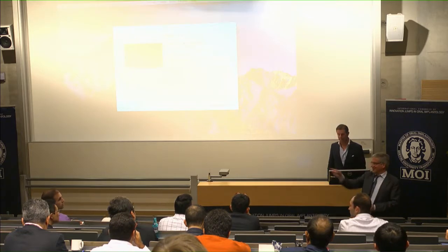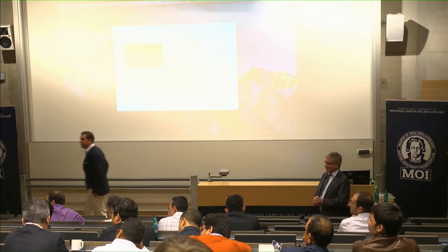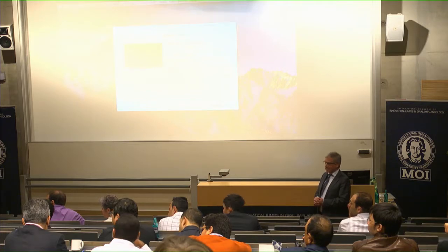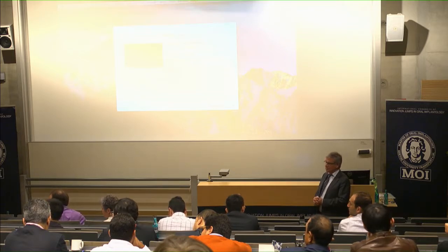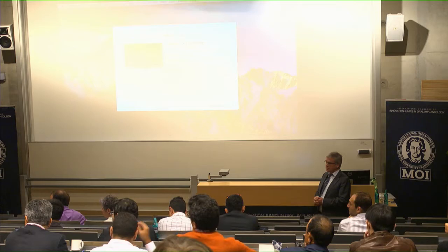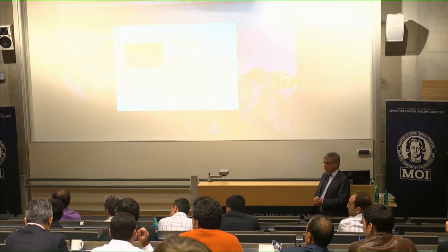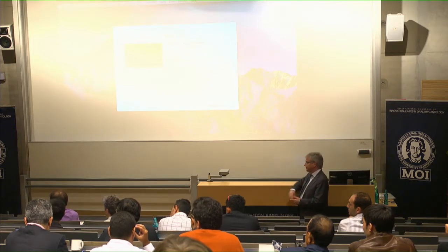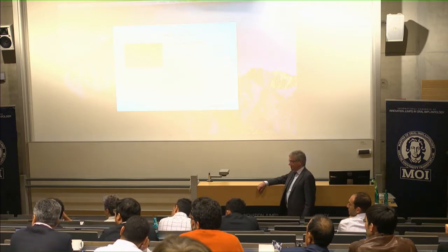Okay, any more questions? A technical question about Implant Studio. Do you fool Implant Studio into thinking that there's an implant to be planned? Because how do you get past the setup? Do you just arbitrarily choose a tooth for implanting? Yeah, and even now I have to design temporary crowns for that implant, which is normally placed in the tuberosity in the upper jaw. But I just place the implant there and also the temporary crown. Oh, gotcha.